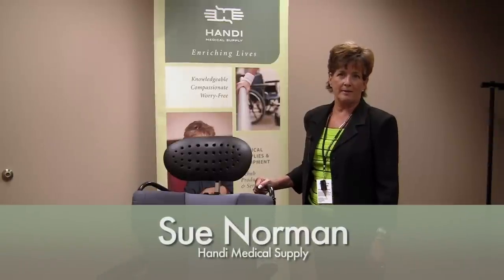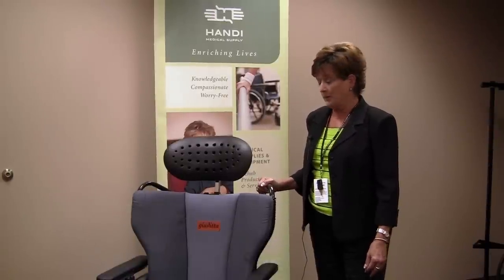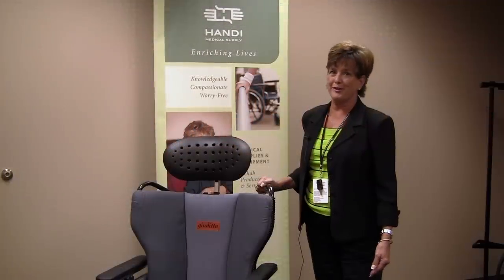Hello, I'm Sue Norman with Handy Medical Supply, Account Manager and Occupational Therapist. Today we're going to be featuring our newest chair, the Judita chair — we're calling it the Judy chair.